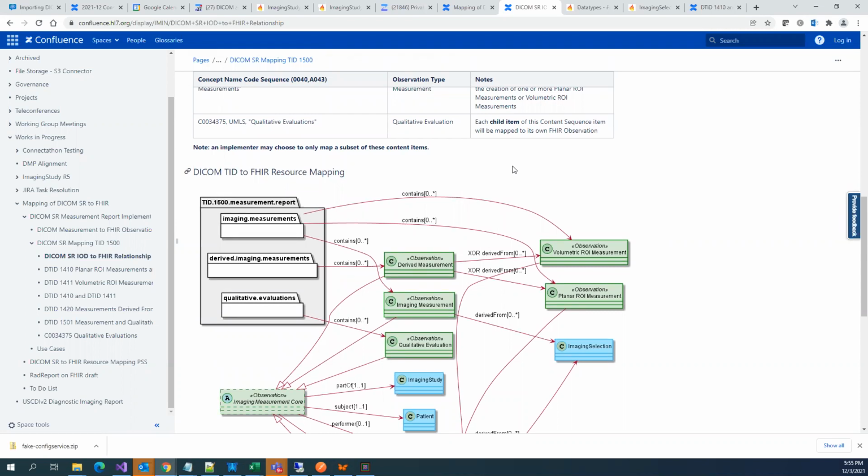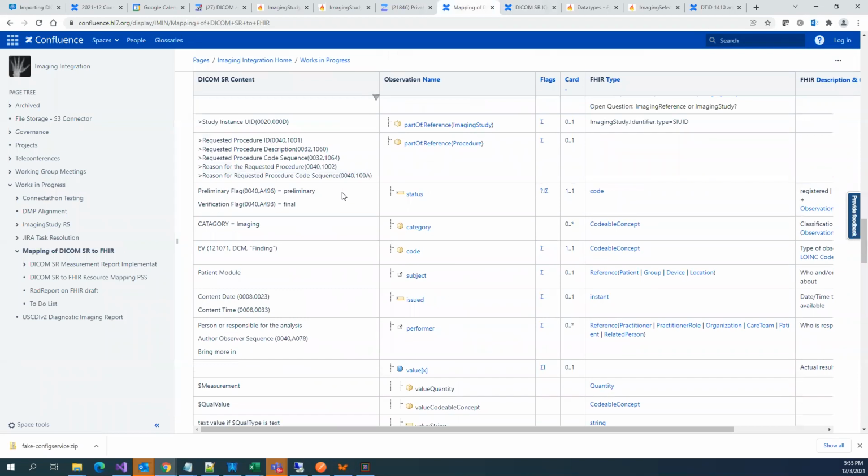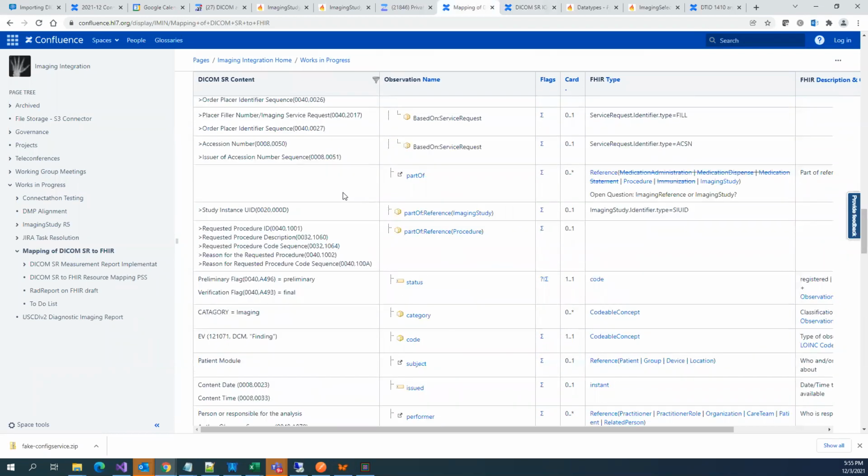The reason I'm asking is you may not need a lot of fields on the resource. Maybe I can just check that, Venu. But right now, in the IG, I did not see anybody talking about profile yet. They only talked about the mapping. There is no clear profile, but I will check and get back, Venu. So far, whatever I have read in this IG, I did not see anybody talking about profile.